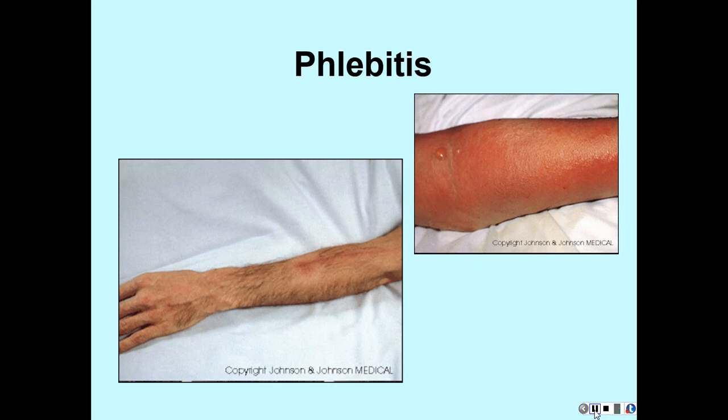Okay. So when I say a mechanical irritation, what do you think that means? Right, that maybe the vein became very irritated because we used too big of a catheter for the vein size. Okay, maybe just our technique on IV insertion caused the irritation. If the catheter is not secured appropriately, it does move.